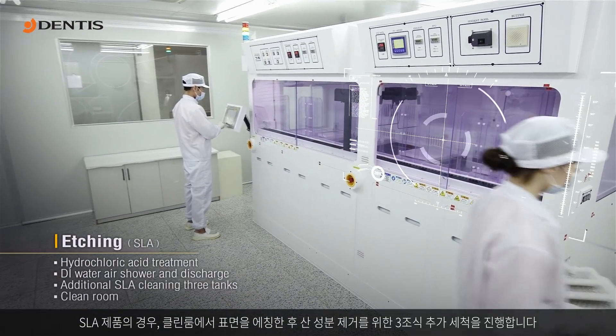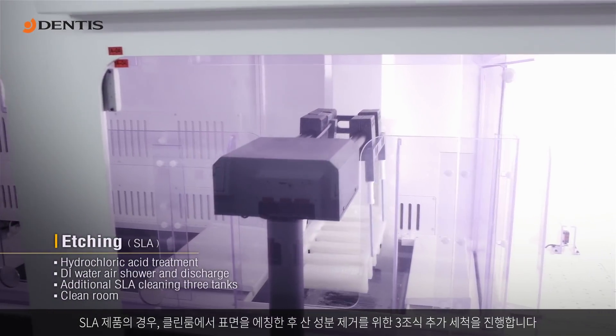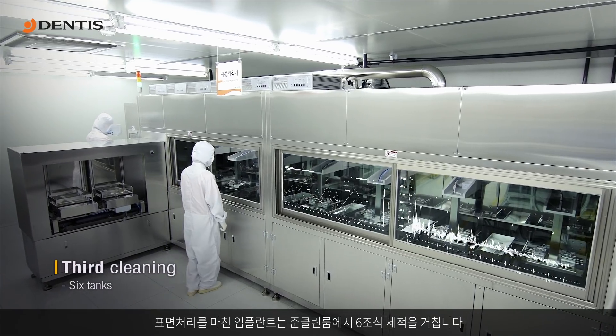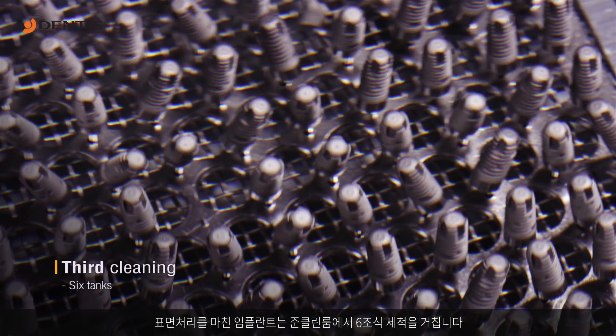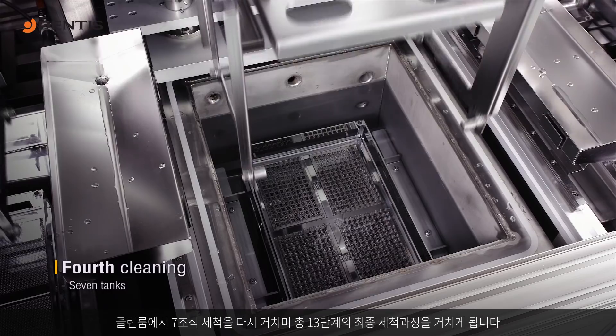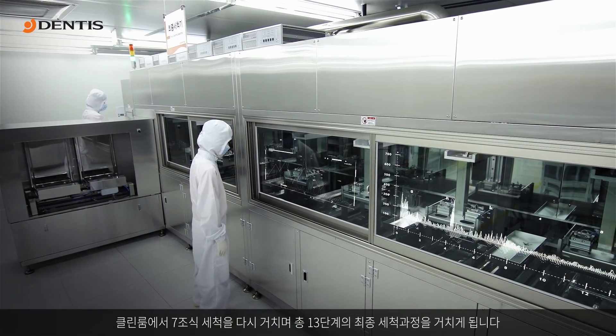SLA products undergo an additional cleaning in three tanks to etch the surfaces and remove acids. Implants that have gone through the surface treatment undergo a 13-step cleaning process, consisting of cleaning in six tanks in the quasi-clean room and cleaning in seven tanks in the clean room.